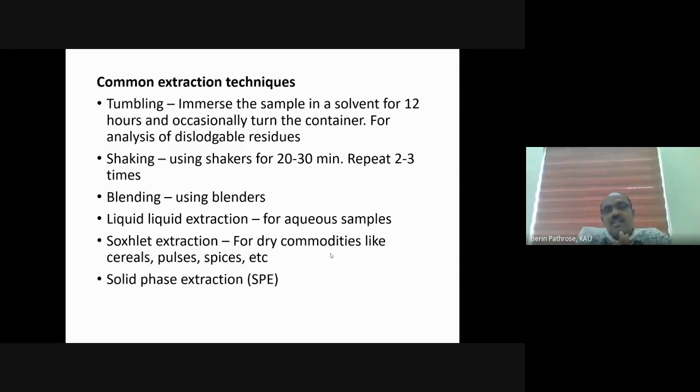There are several extraction techniques employed for extracting pesticide. Nowadays the most common extraction method used is the QuEChERS method, which we will describe later. But we will slowly discuss different extraction methods because certain commodities require a particular method of extraction.